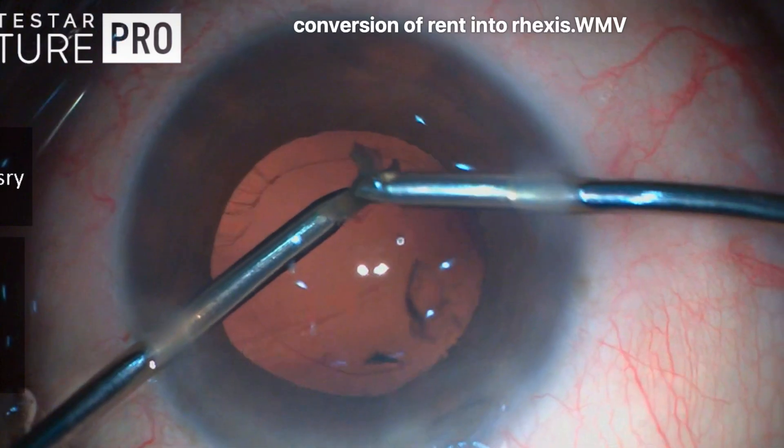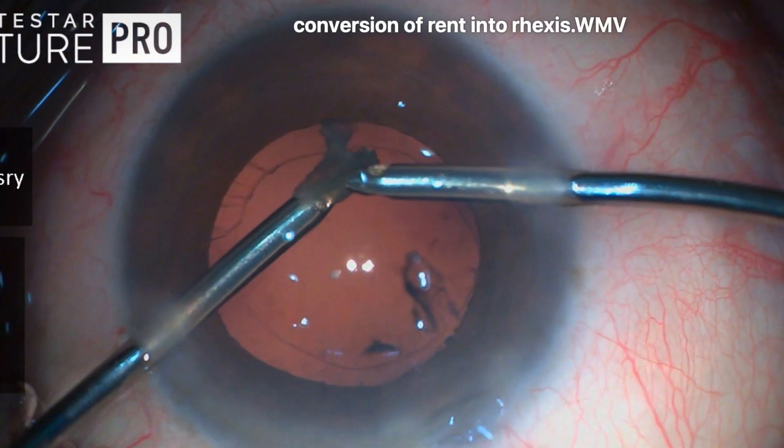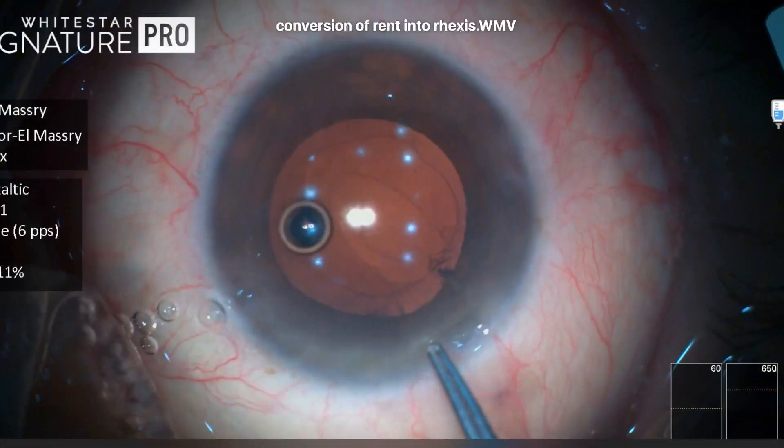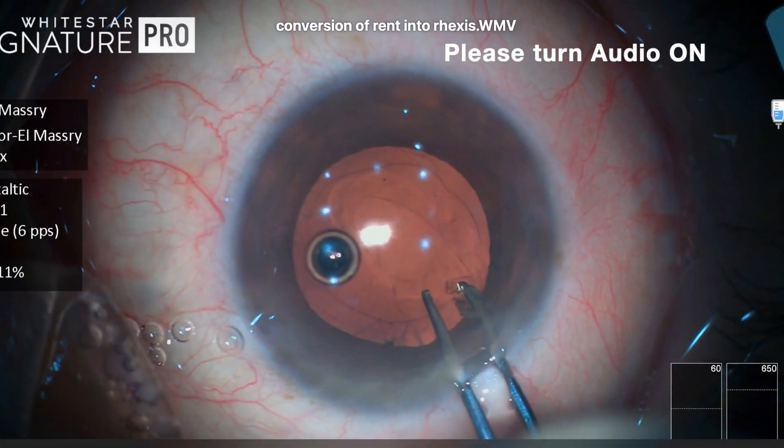Here we have a replay showing that the posterior capsule was engaged in the aspiration port momentarily, and this resulted in a small tear which has extended — but fortunately it didn't extend to the equator.